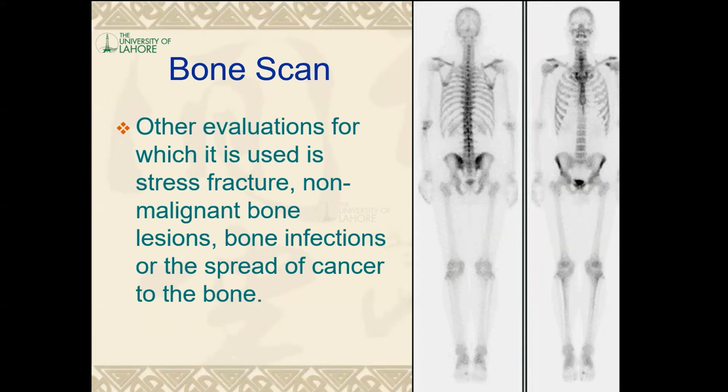So it's used for detection and diagnosis of stress fracture, non-malignant bone lesion, bone infection, or spread of any cancer to the bone.